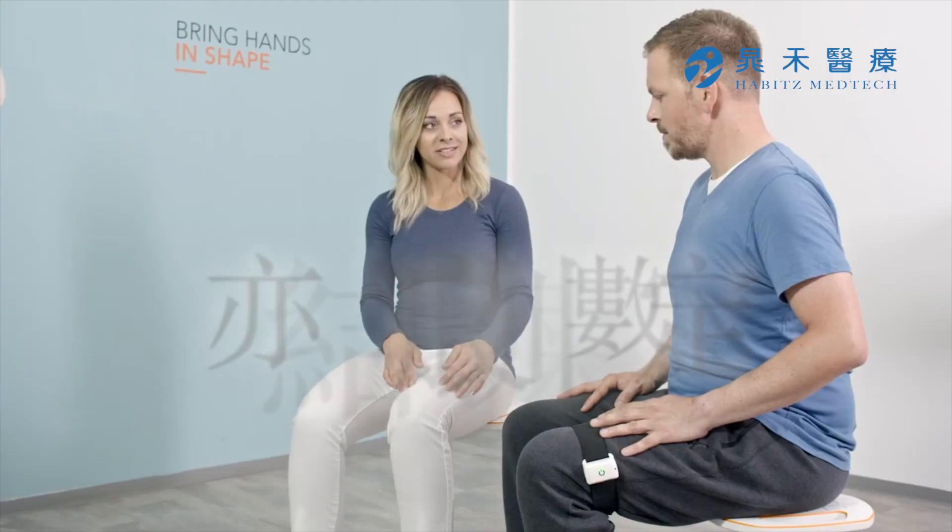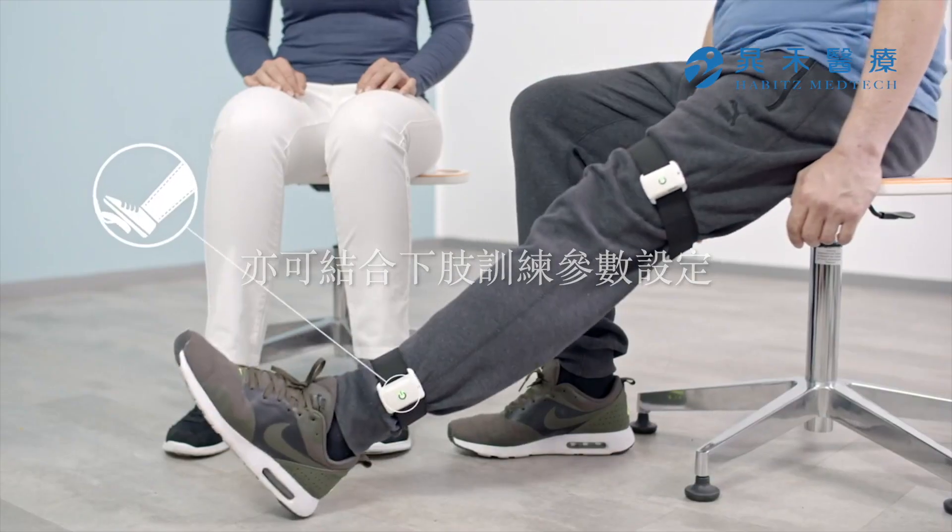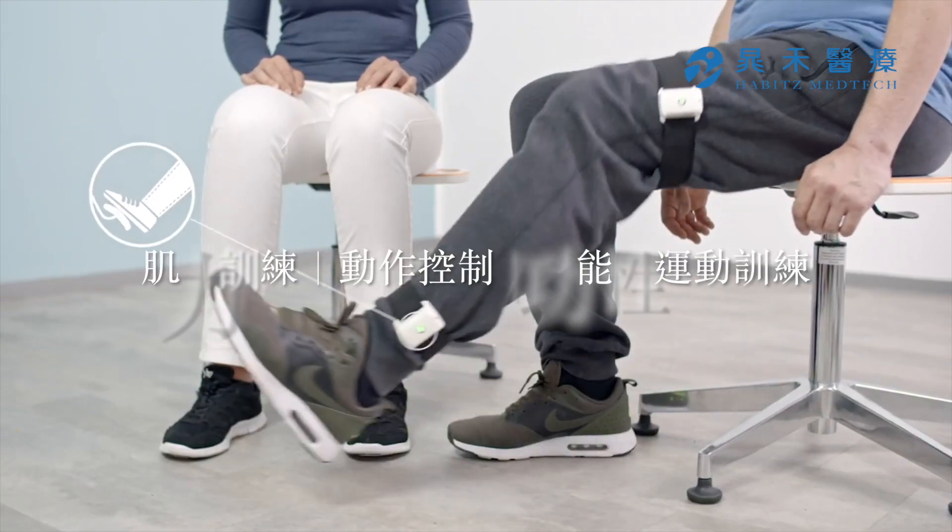Pablo's motion sensors can also be attached to a patient's lower body, allowing for strength building, body control, and functional exercises.